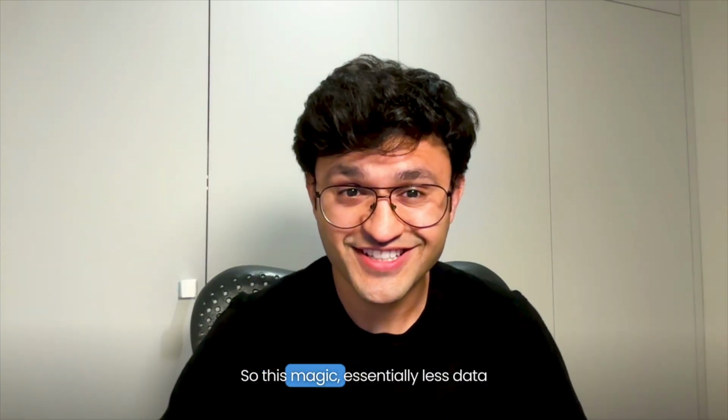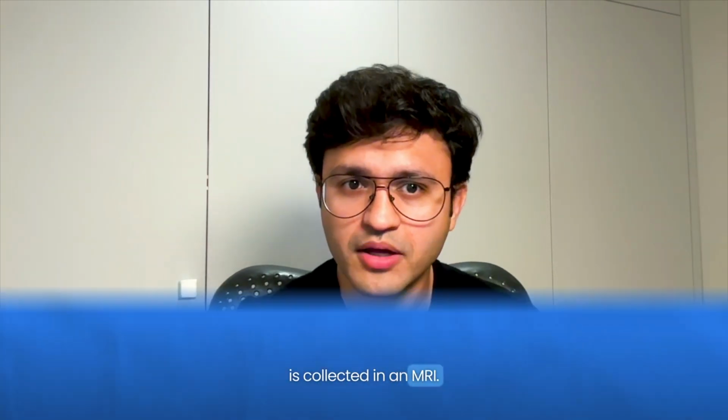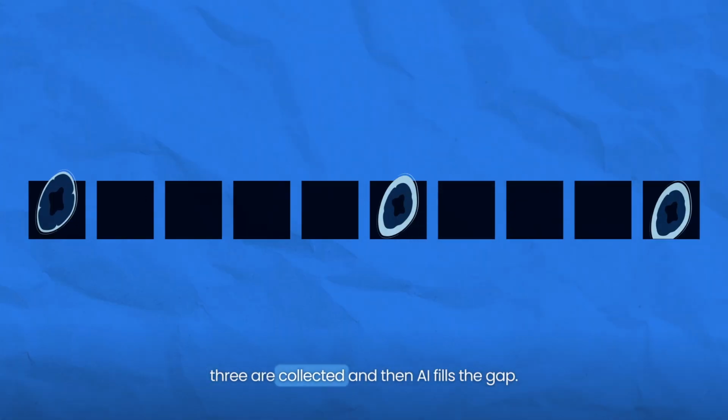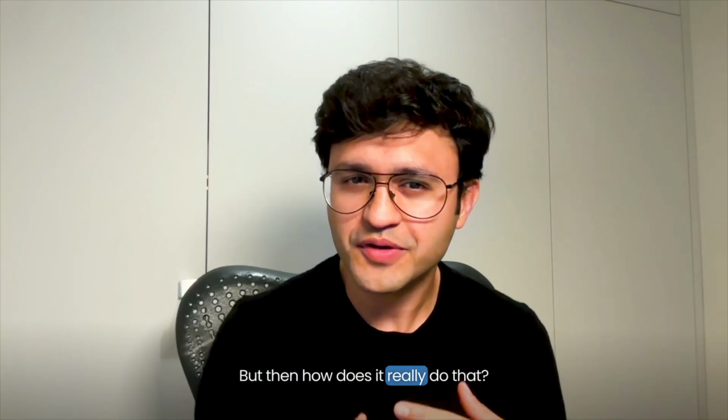So with this magic, essentially, less data is collected in an MRI. Like say if you collect 10 data points, only 3 are collected, and then AI fills the gap. AI will fill out the rest of the 7. But then how does it really do that?